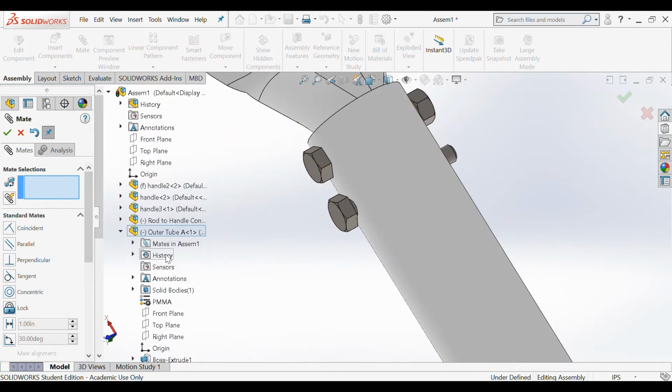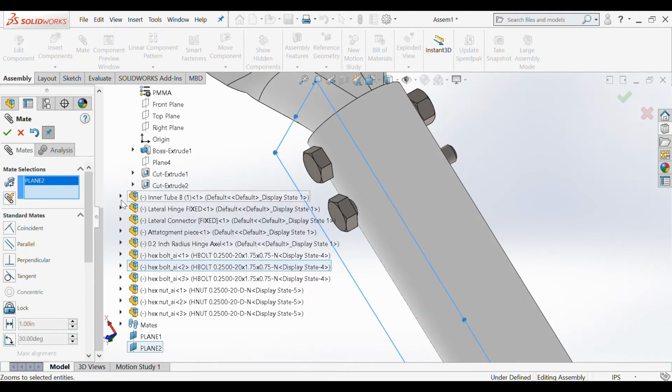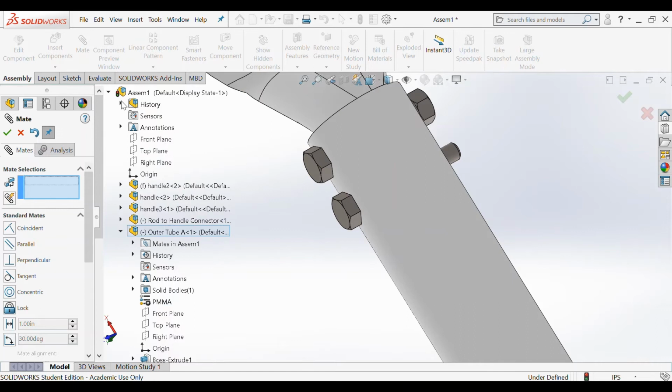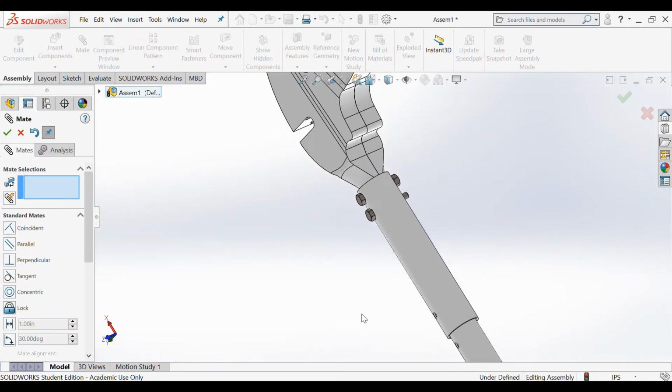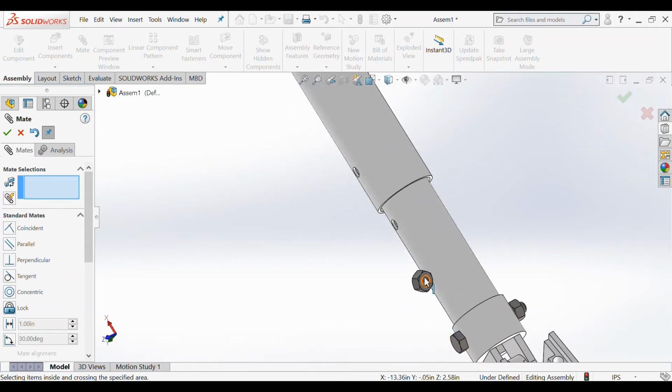And then, like I did with the other one, I'm going to make this reference plane that we created earlier, and I'm going to mate it to the top surface of this bolt. I'm going to choose the distance between the two to be 0.19 inches. And I'm going to click the check mark. Next, I'm going to add the nut. So I'm going to drag it over.